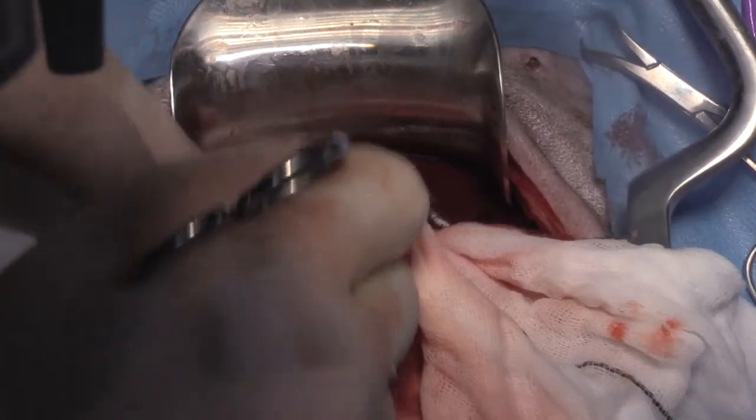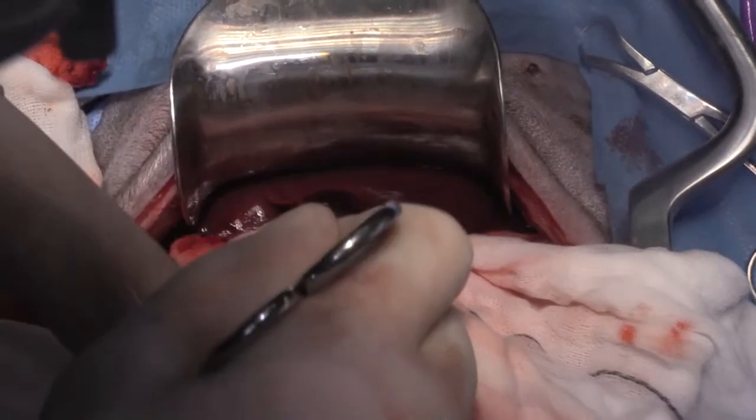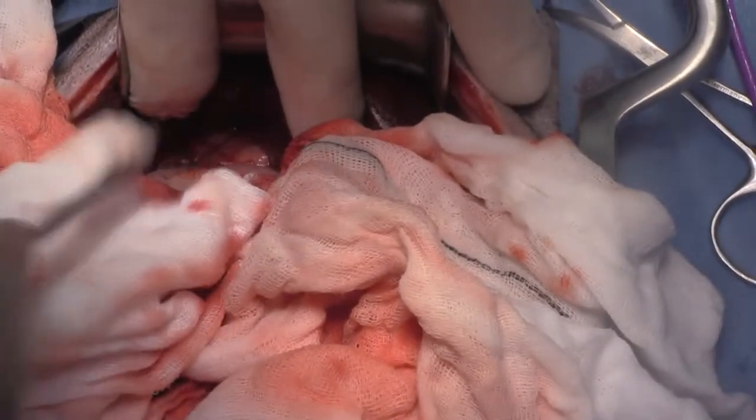So if you guys have any questions on that at the moment, we'll take them. Sample out of that gallbladder for culture as well. I'm not sure if Paul wanted that, but we will do that. There's not a lot of oozing now from this liver. Everything's kind of controlled itself. A sample of just the bile, or do you want the tissue sample? No, I'll just take the bile.